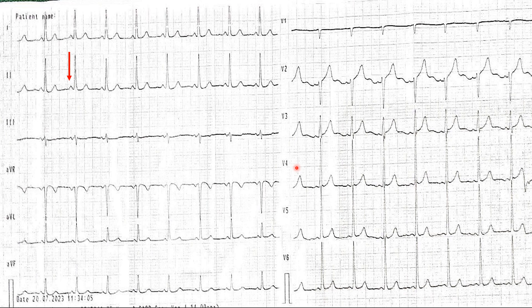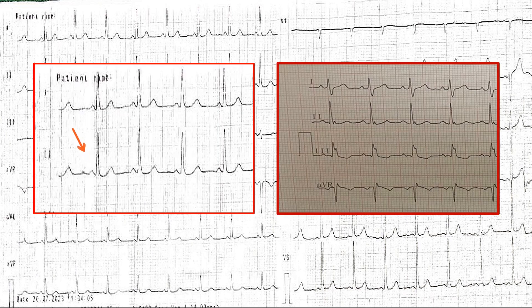Now what is the important and interesting finding on the ECG? I have zoomed in on the important findings for this patient. On the left-hand side, the arrow is pointing towards that finding — this is a short PR interval. Look at the leads: the P wave is just finishing and the QRS is starting. On the right-hand side, the PR interval appears to be a normal PR interval, and the P wave is classically separate from the QRS complex. This is not the case on the left side.